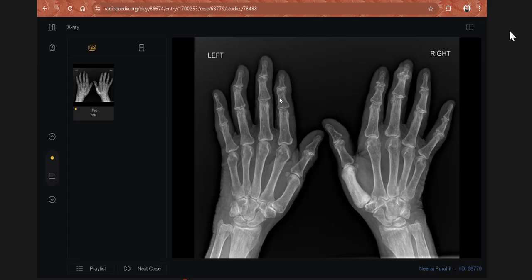You say fibrous dysplasia. What is the appearance of the matrix in fibrous dysplasia? They're ground glass matrix, but considering the other associated pathology, it is very less likely. So you say this is the axis. This one is actually expanded. Yes, sir. While considering the expansion, what do you think? What will be the cause?